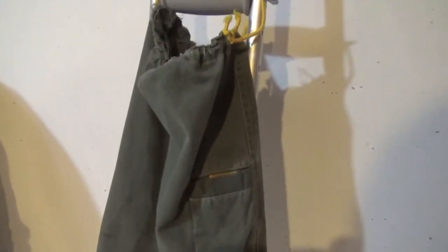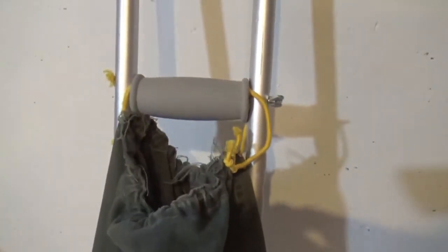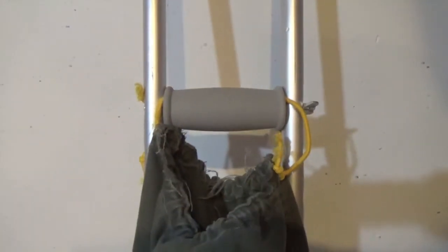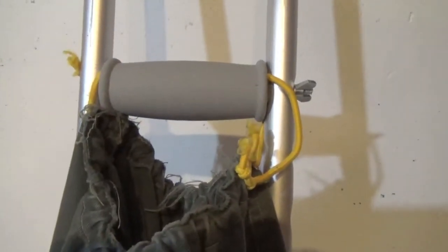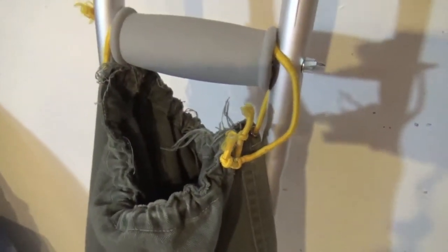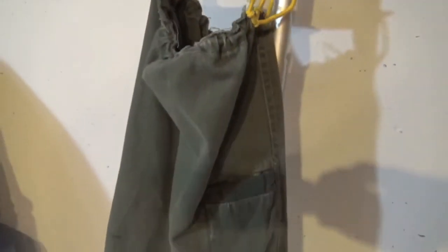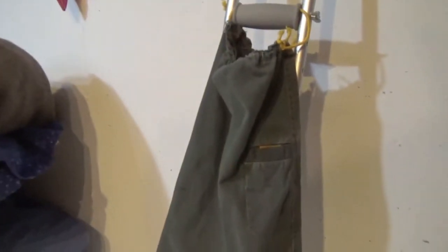Okay, and here you can see the final product, and actually this is about 3 months later since I made this little thing here, and it served its purpose extremely well. The person who was using this was able to put their belongings down inside their little crutch pouch here and go to the grocery store, go wherever they needed to go, walk through the house. You can put a book down there. You can fit a lot of things down there, and you're not trying to carry stuff around in your hands while at the same time that you're on your crutches. And you don't have a bag looped over your shoulder, throwing you off balance and all that kind of stuff.